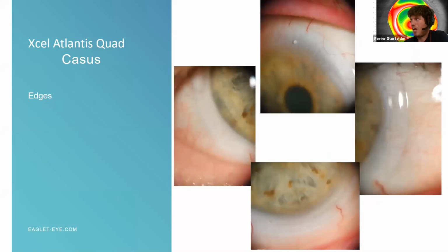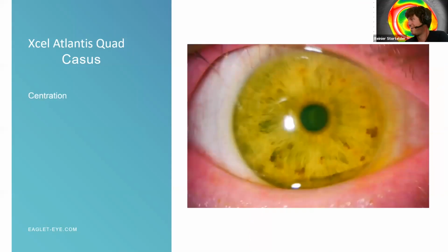Showing how it looks. So this was just the first fit that we have done. I believe this is the perfect fit, so smooth looking edges, no impingement at all. So for me, the perfect fit.